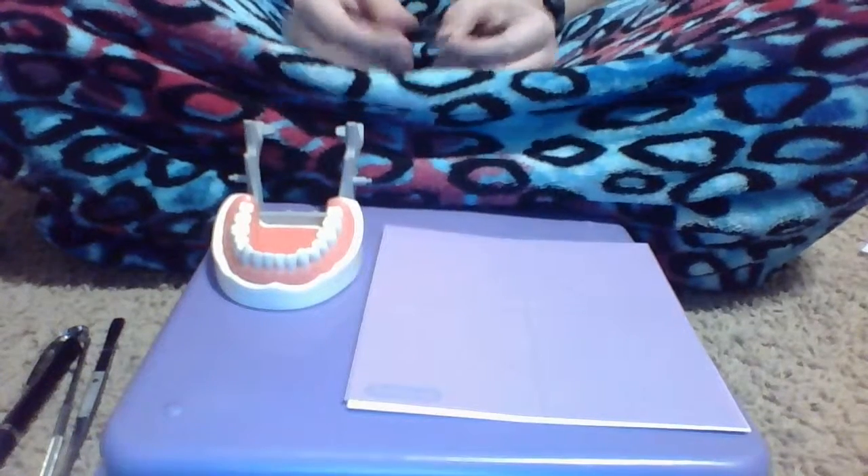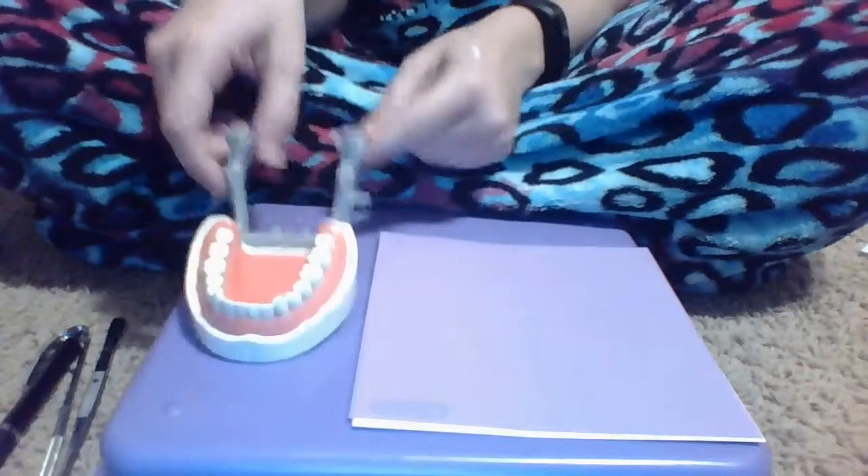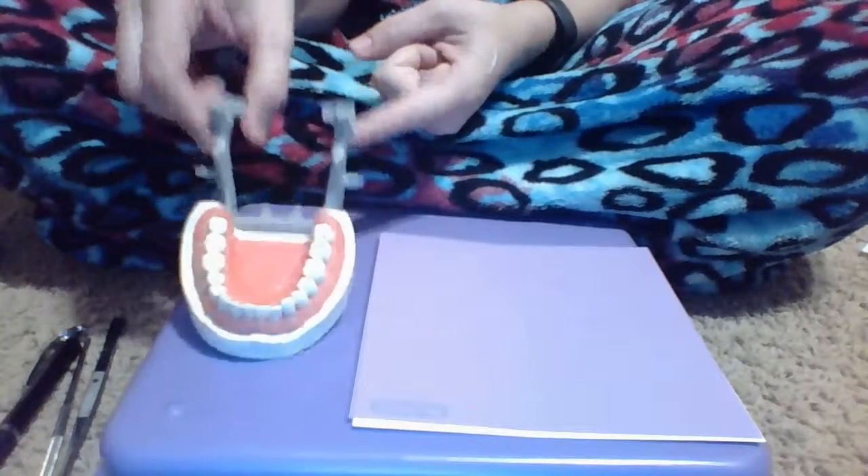Hi everyone! Today I'm going to show you how to correctly place a dental dam on my typodont.